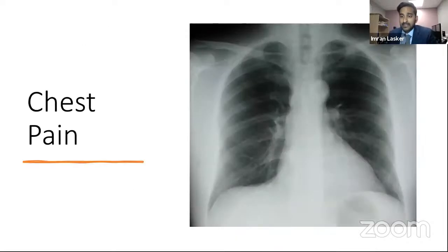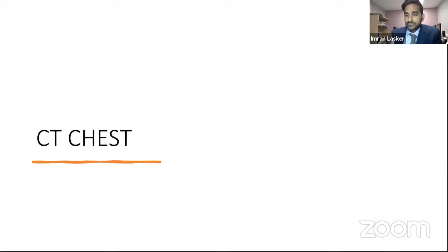So look, I just thought moving forwards, let's give you guys a scenario. If you've got a patient, let's say they're 50 years old, with chest pain, most of the time you're going to get a chest x-ray, but the chest x-ray looks normal. So you think to yourself, I think I need to get a CT scan.